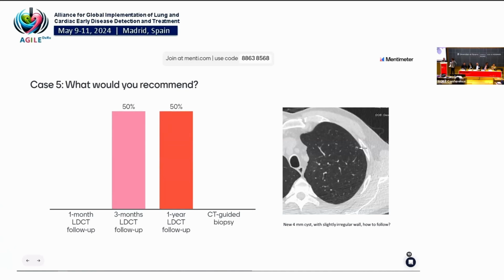Baseline, yes, baseline. Well, it says no, but I guess it's just baseline. Ah, sorry, and it says new. Does it matter? A little bit. Yeah, because it's more than 3 millimeters. It's new. If it's new, it's different because it's more than 3 millimeters.